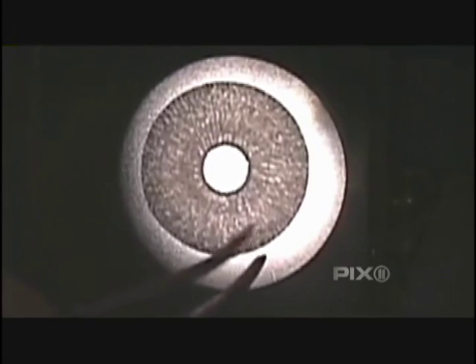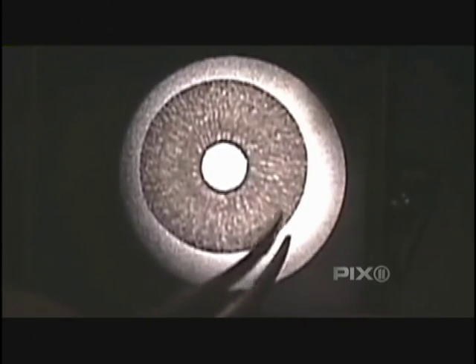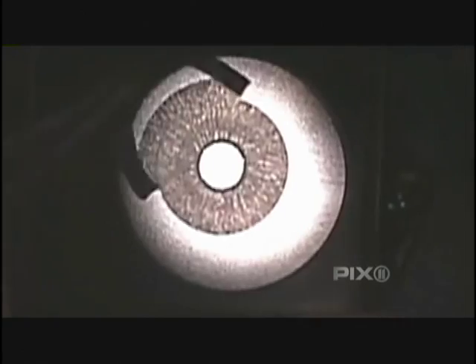Okay, I want to get to the actual surgery itself, where you actually implant the silicone iris implant. So let's take a look at this, and you can kind of walk us through. What are we seeing here? So this is the handmade iris prosthetic. This is actually from the young fellow we looked at before with congenital aniridia. We use a trephine, a little cookie cutter, to cut this to size because it comes a little bit larger than we need.